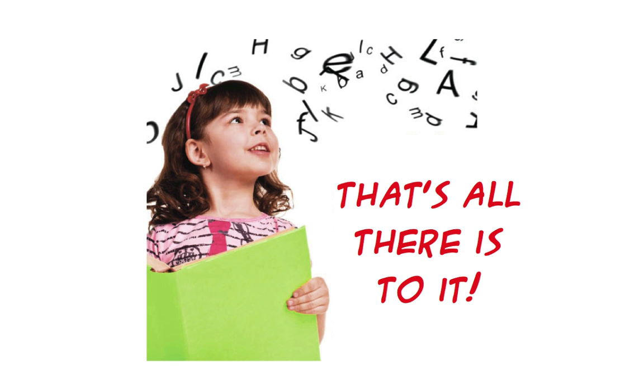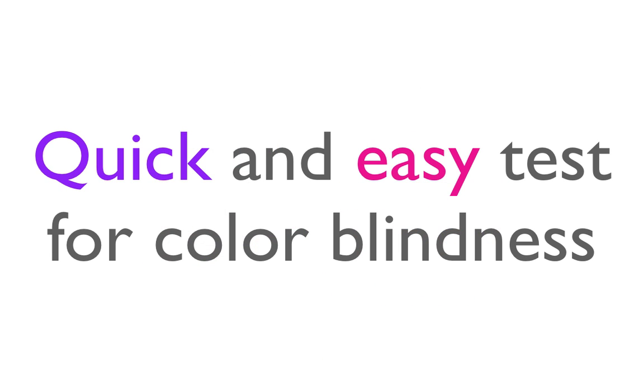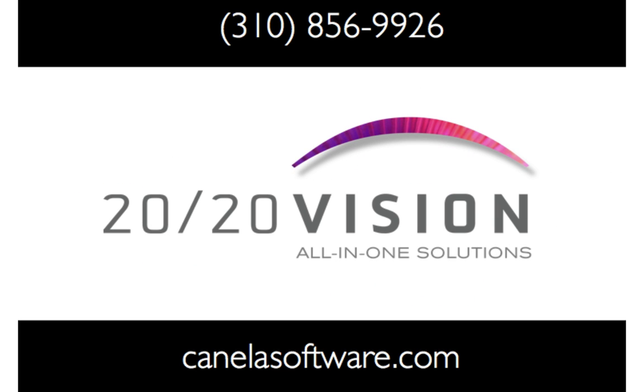That's all there is to it. You now have a quick and easy way to test for color blindness. For more screencasts on 20-20 Vision, visit us at canellasoftware.com and see for yourself the clear, focused solutions of 20-20 Vision.